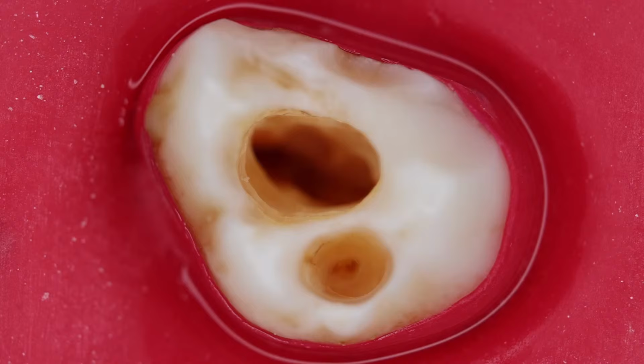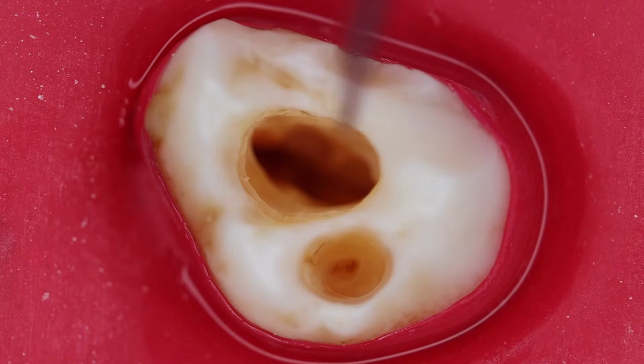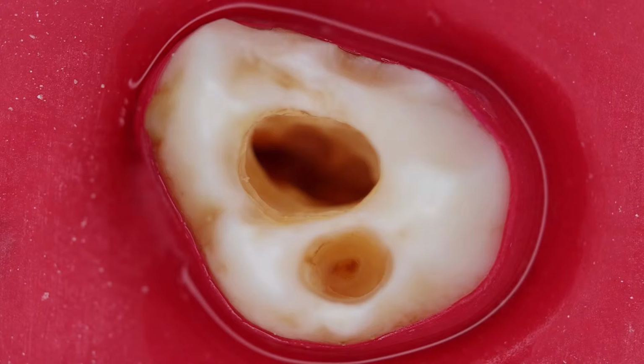Welcome to the session today. This is a continuation of the previous one where we did the access opening and entered into the root canals of this maxillary molar. We removed all the caries that was there, and now we are into the root canals. We are entering the root canals.